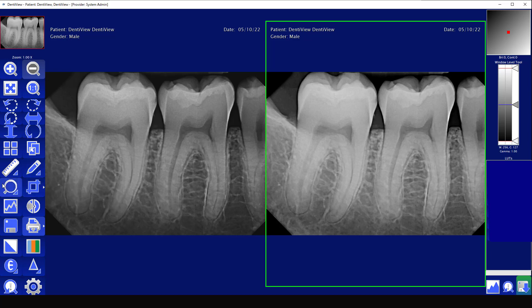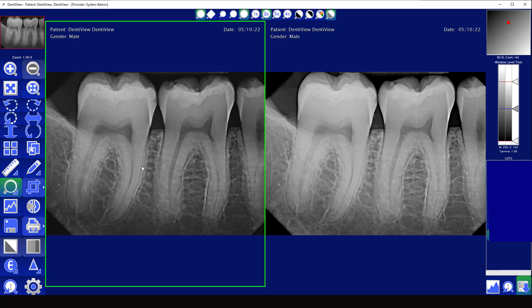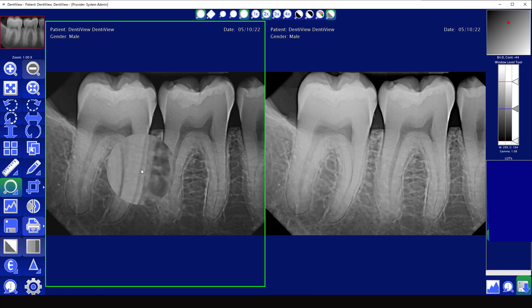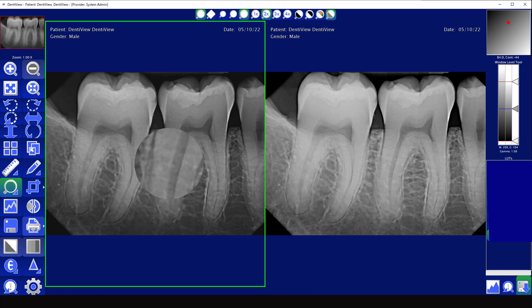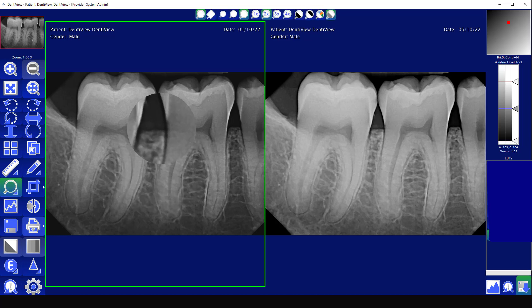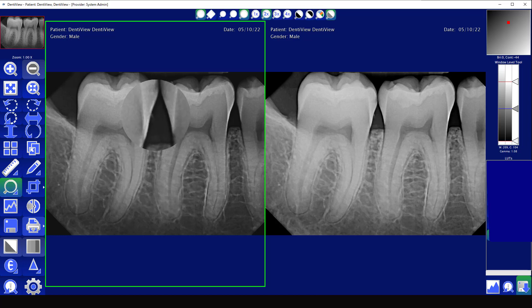The next button is the magnify button. This allows you to magnify a specific spot on your image so that you can see that specific area magnified.